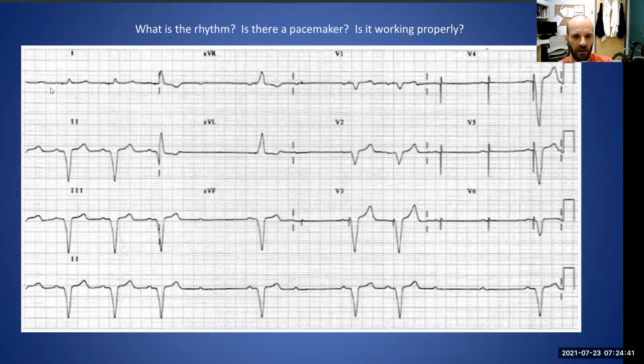Depending on the electrode pair that you're choosing to look at, which is what each of these leads represents, sometimes the spike is going to look bigger if the energy is moving in the direction parallel to those leads. Sometimes the spike is going to look smaller if the direction in which that energy is moving is perpendicular to the direction of those leads. So sometimes it looks bigger, sometimes it looks smaller. Good question.